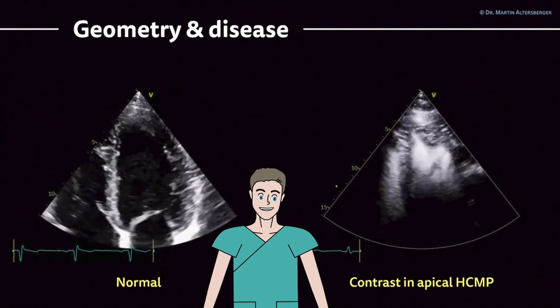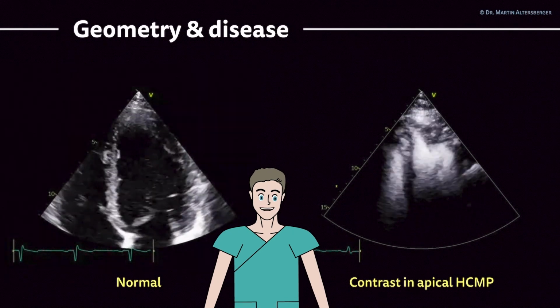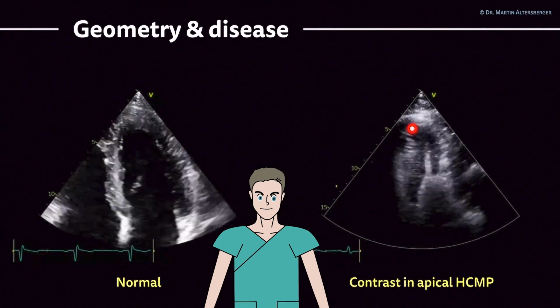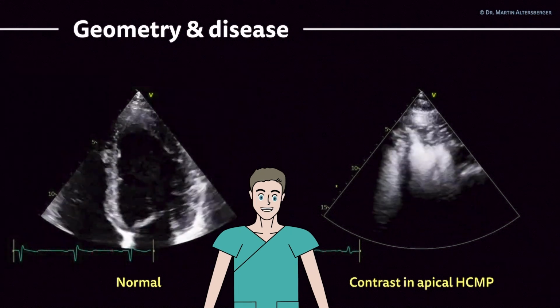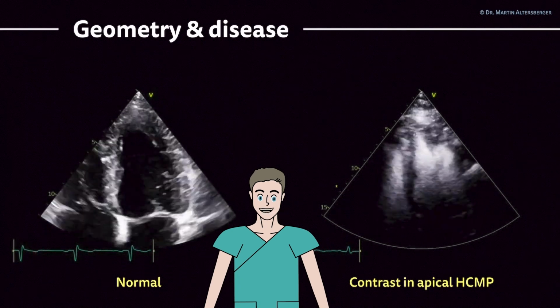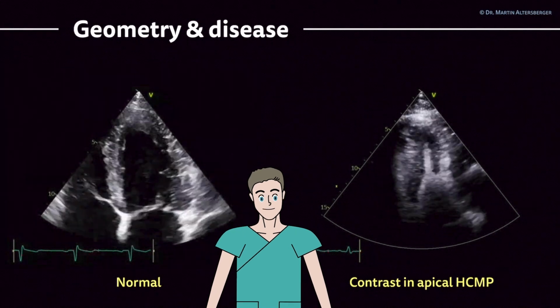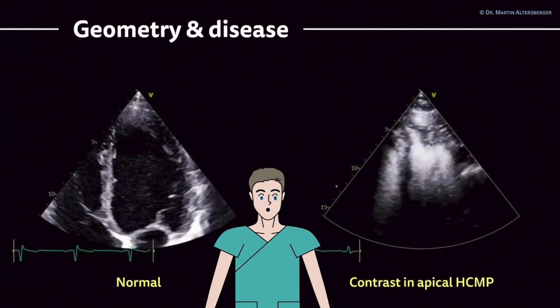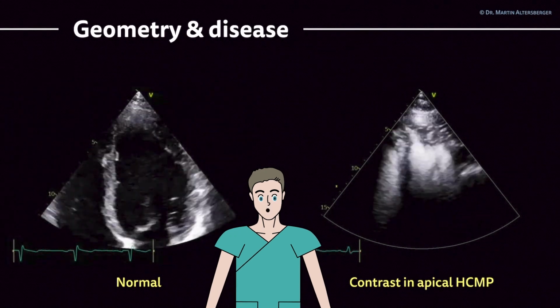If there would be an aneurysm of a certain size, about 15 millimeters, anticoagulation actually is mandatory in those patients. So you can see that here the heart fills, and even up to the apex where we see the most hypertrophied segments in this apical hypertrophic cardiomyopathy, also called Yamaguchi syndrome, you do not see thrombi, you do not see an aneurysm, and again, contrast gives a lot of additional information. Overall, ejection fraction is normal in this patient. Of course, due to the hypertrophy, also parts of the ventricle are simply smaller, so even the ejection fraction can be overestimated compared to the true left ventricular function which is present.